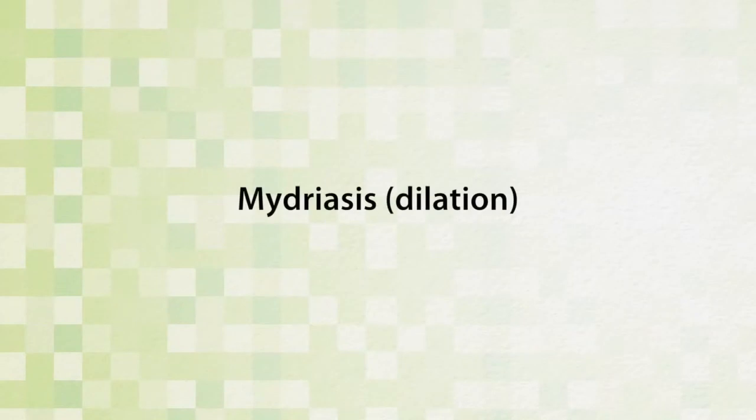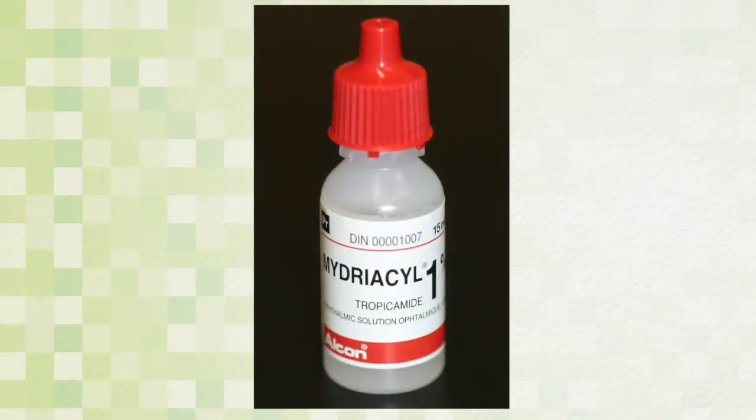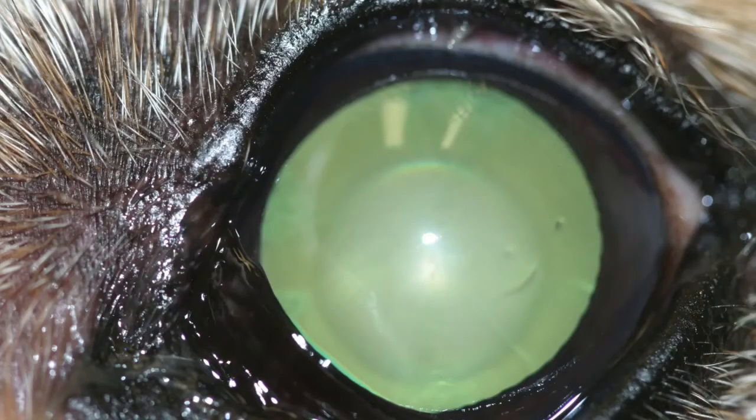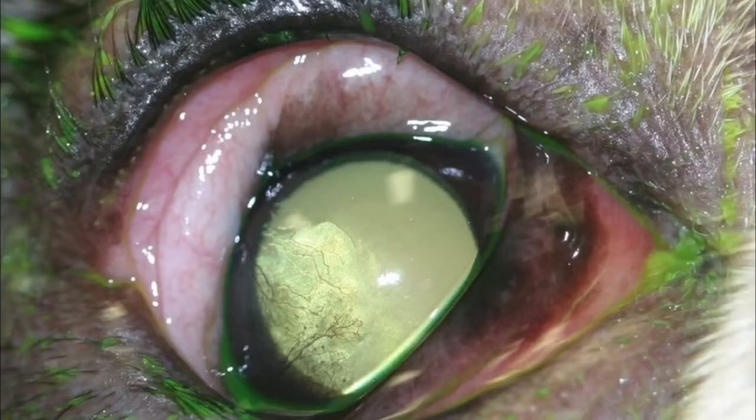Once the neuroophthalmic examination and ocular diagnostic tests are completed, it is important to instill drops to achieve mydriasis. Mydriasis is necessary for a complete ocular examination of the lens, vitreous, and fundus. The presence of a dilated pupil also aids in retroillumination, which is essential to highlight lesions in clear media such as the cornea, aqueous, lens, and vitreous.